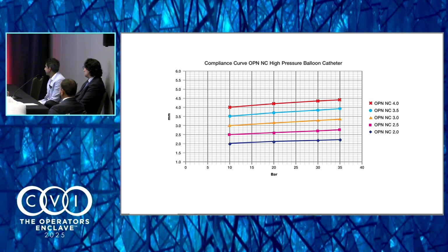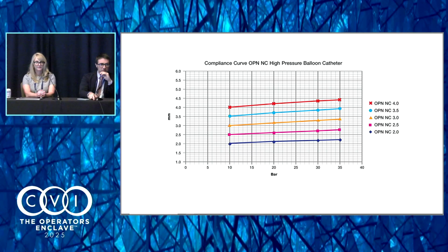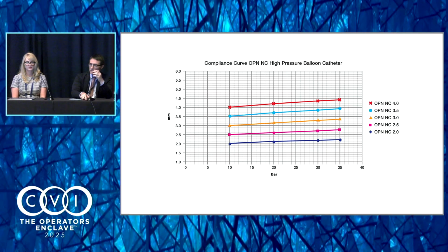Perfect. I completely agree with you. Every cath lab doing complex PCI should have this one. I think the OPN NC balloon works very well alone, but the combination is maybe the future of what we will see in lesion preparation and expansion.